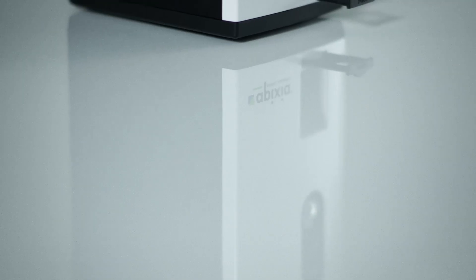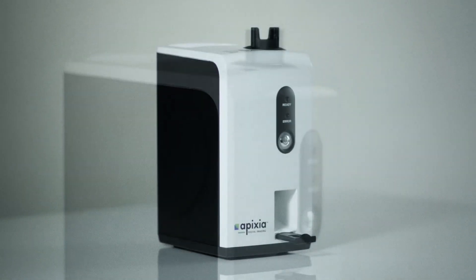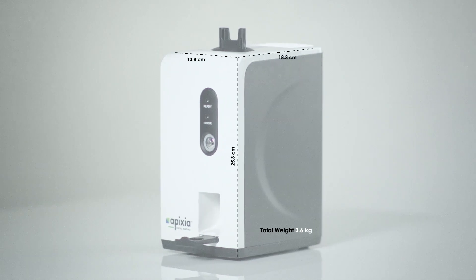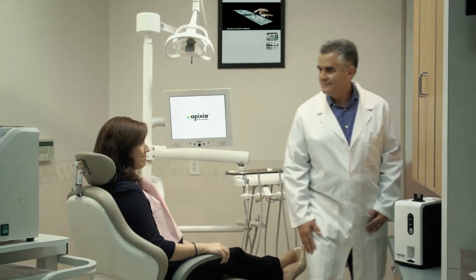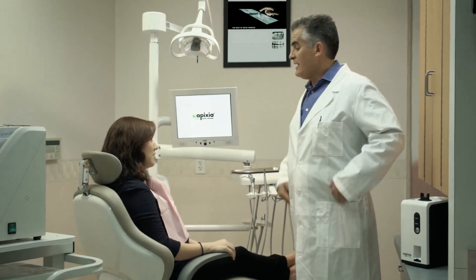The Digirex PSP scanner packs tremendous imaging power into a small package. Tiny enough to fit into the most crowded dental operatories, yet robust enough to be placed in a central location for use by the entire office. The Digirex PSP scanner is the ideal product for any size dental practice.